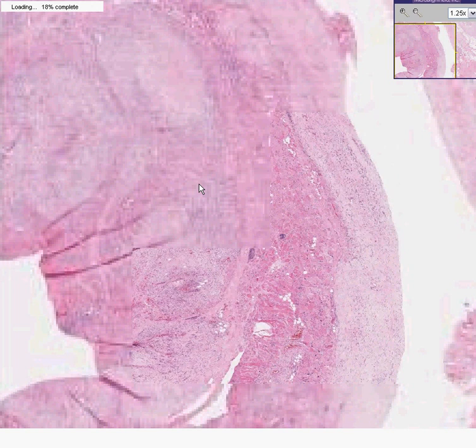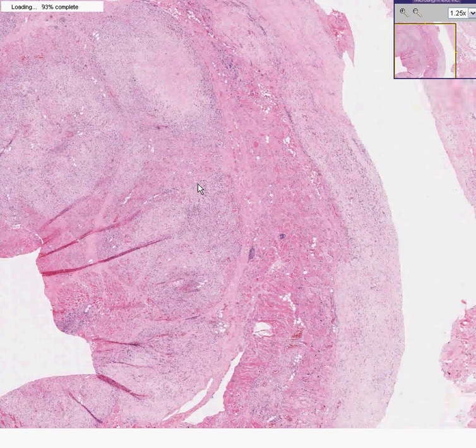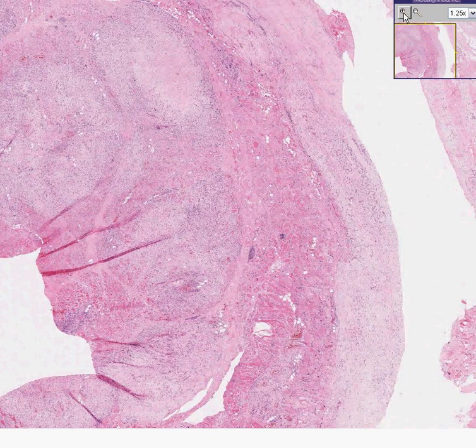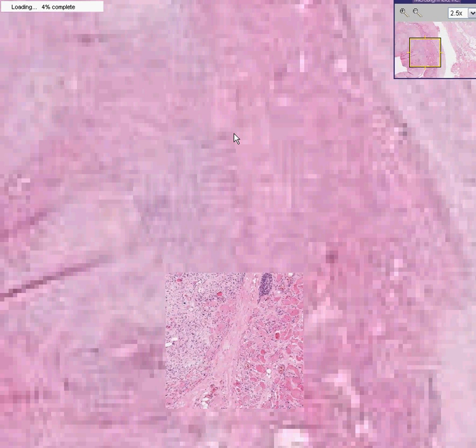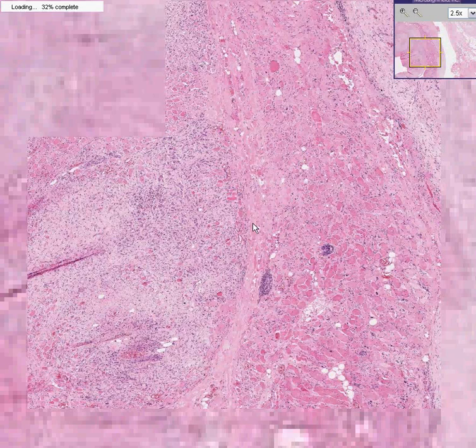Sometimes the cells are so small and subtle you kind of miss it. You think, where's the tumor and why is the stomach wall so thick? But actually the tumor is very intimately dispersed, often as individual cells and sometimes as small nests, like you see here, throughout the entire thickness of the stomach.